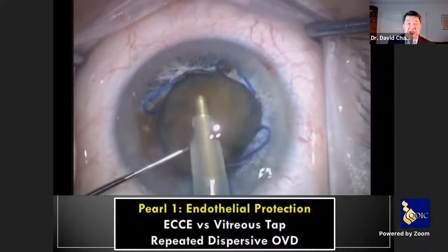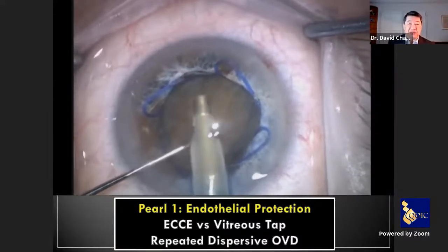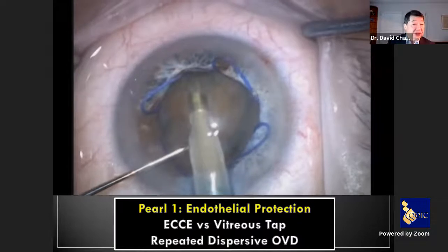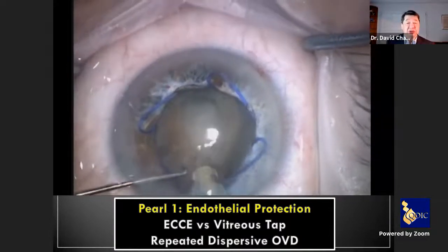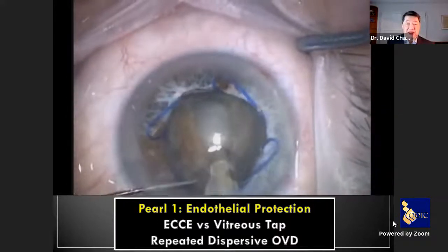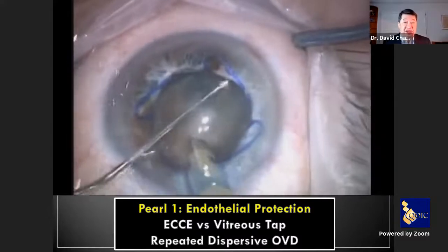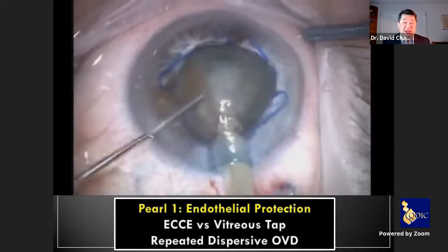So what should I do? I guess I can start to debulk the lens a little bit and maybe try to hydrodissect again and try to turn it again. But if you force it, you can create a zonular dialysis very easily. So my strategy is actually going to be to, at some point, put in capsule retractors to give me the peripheral and the capsular stability and countertraction. Sometimes you use two instruments to try to turn the lens, but it is not a turning.